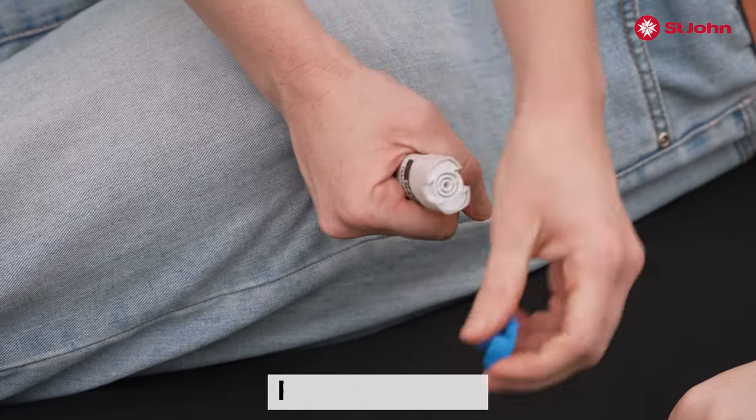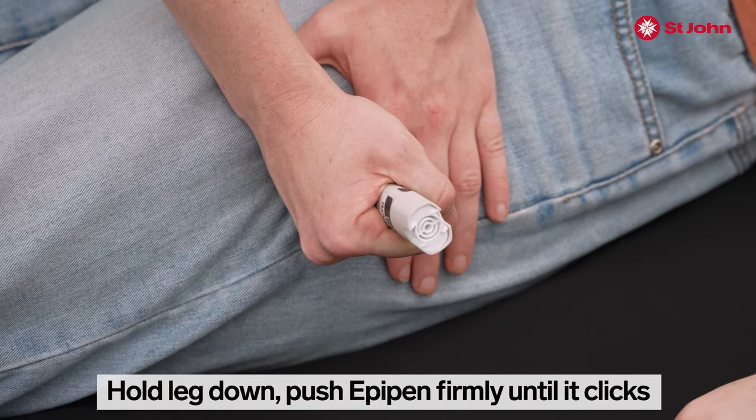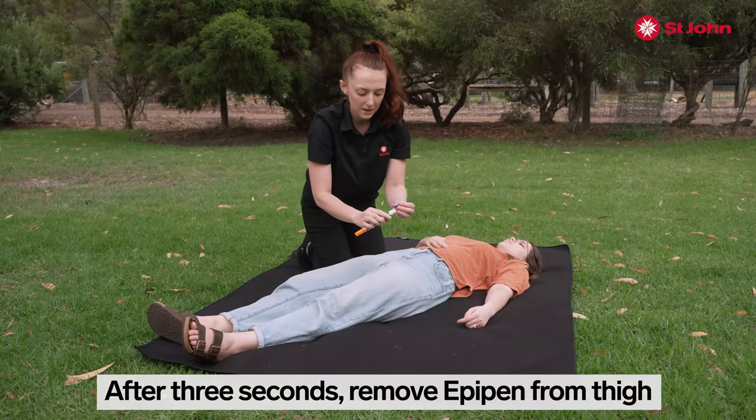Remove the blue cap, hold the leg down and push in until it clicks. Count one, two, three. After three seconds, you can remove the EpiPen.